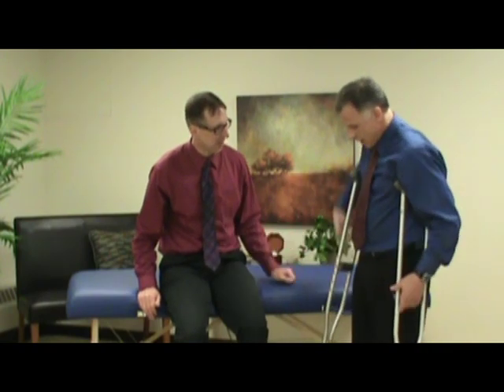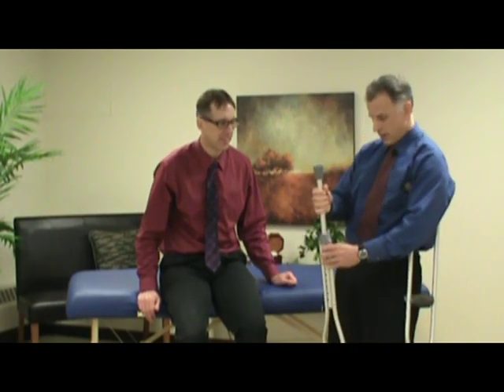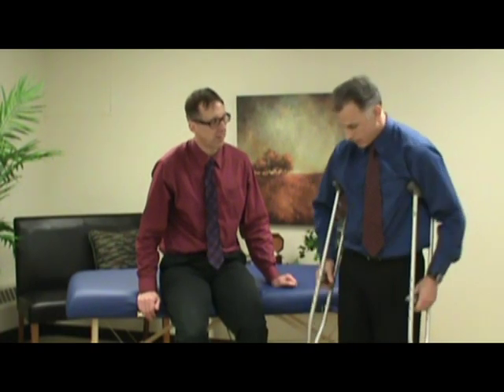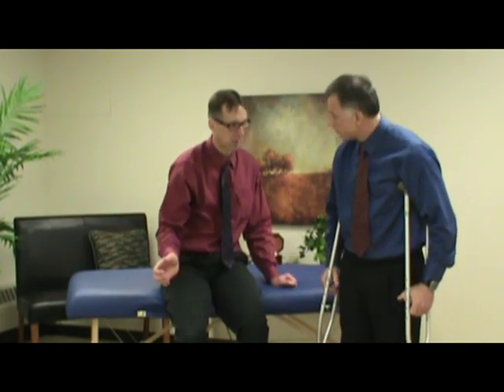Both of them should be the same. Obviously here I'm a little asymmetrical, or uneven. All right, so we adjust them both at 5'8". Now we have to get the grips correct.